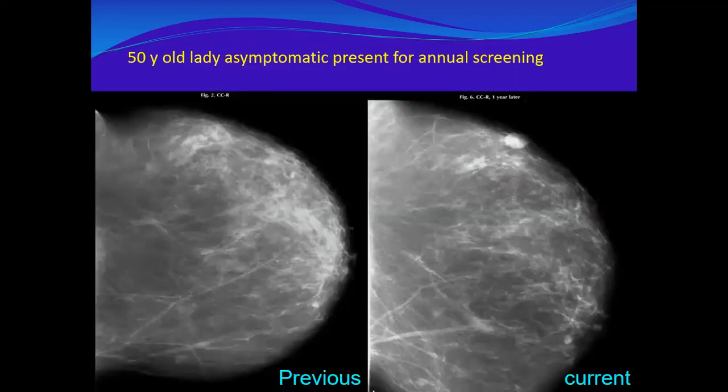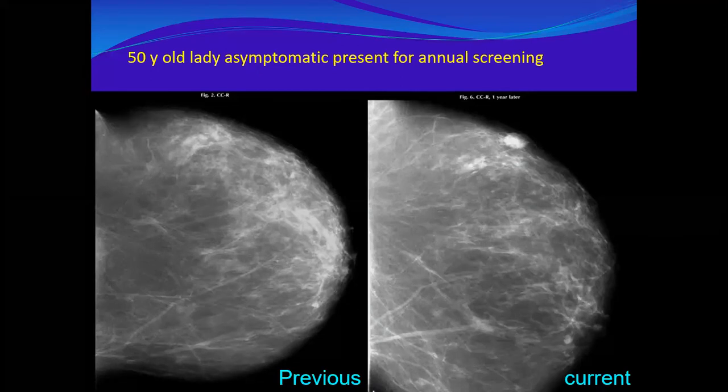Okay, next patient. Time passes quickly. This is straightforward now. I need from you just, even without telling me where exactly, whether there is asymmetry or not, and what type of asymmetry.